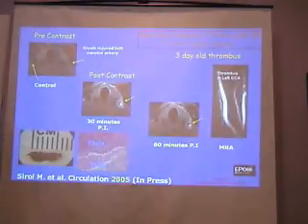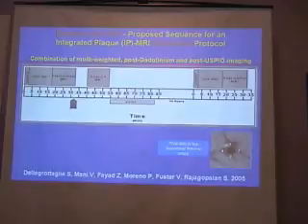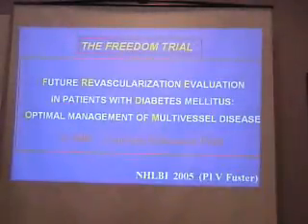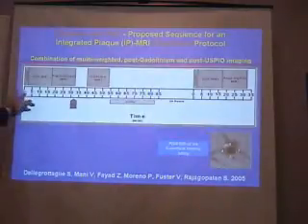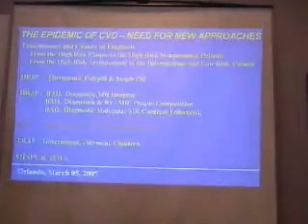And you're saying, so what? Now we are going to patients with all of this. And we are going again to the FREEDOM trial. And we are going to address peripheral vascular disease like you do immunofluorescence, to see all the components of the plaques. And this is the study. And actually it's going to be done in sequence. All the things I presented to you are going to be injected in sequence, and looking at the legs of patients where you can identify these components and begin to use new ways of therapy. This is what we call molecular MR, and it's quite exciting.